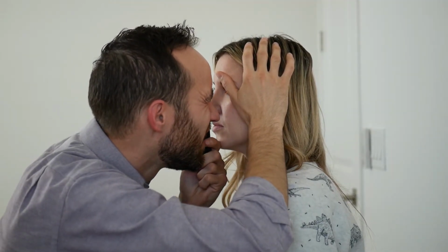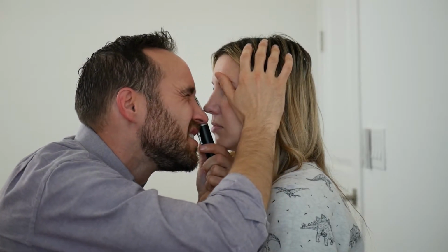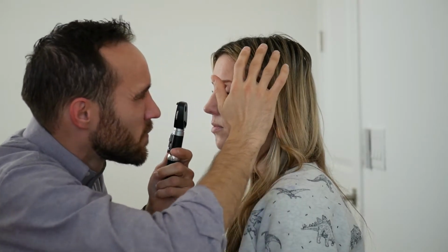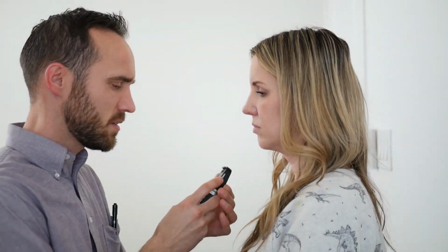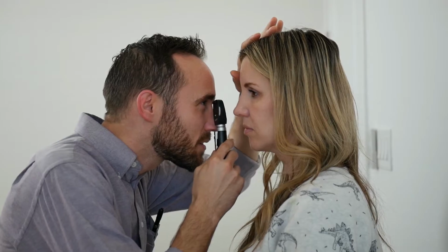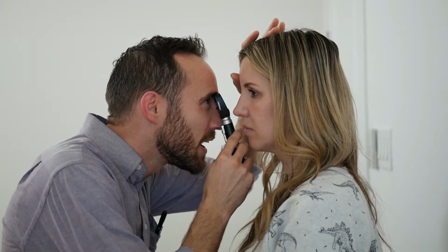Aneurysms, I meant, not herniations. Perfect. Thank you. Now I'm going to assess the macula, lastly, which would be a discolored region, avascular, hanging out by the optic disc, about the optic disc's width away from the optic disc.